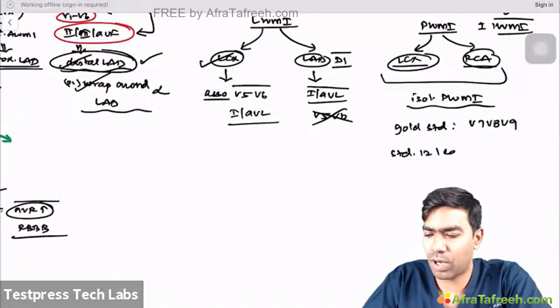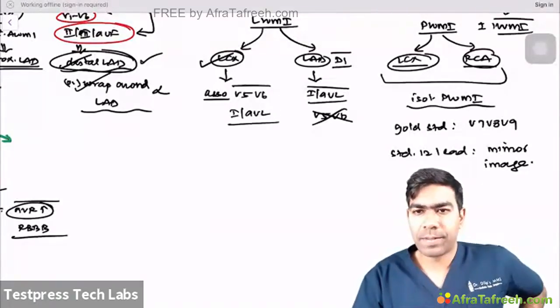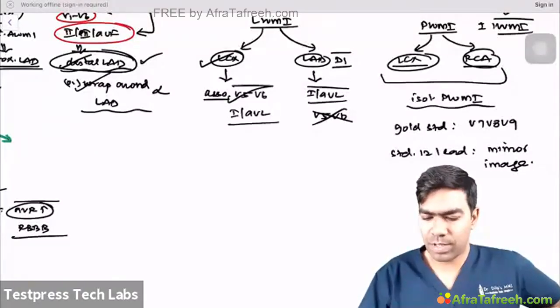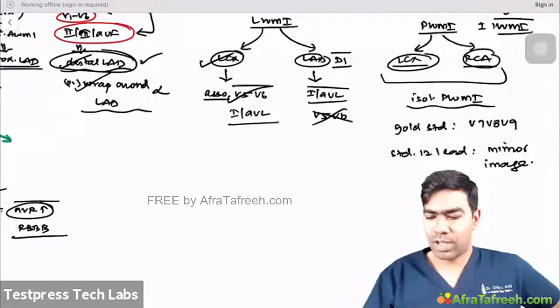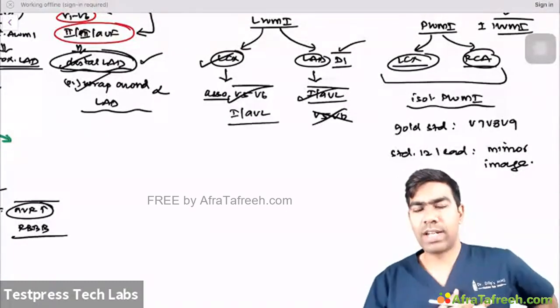If you want to know how to find out in the standard 12 lead ECG, you have to know something called a mirror image pattern. If you take V7, V8 and V9, the exact mirror image, that is opposite, is seen. D1 occlusion and obtuse marginal are almost the same. There is no difference, I'll come back to that. Obtuse marginal also will show similar changes, V5, V6, 1 and AVL only. Main LCX occlusion also will show V5, V6, 1 and AVL only. Only if you see changes in 1 and AVL, very high lateral, then you can think about a D1 involvement. That's all.